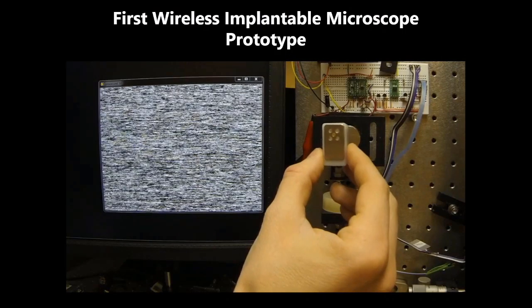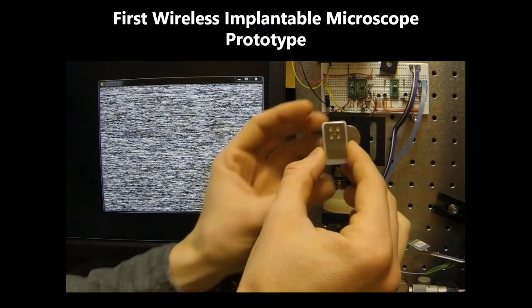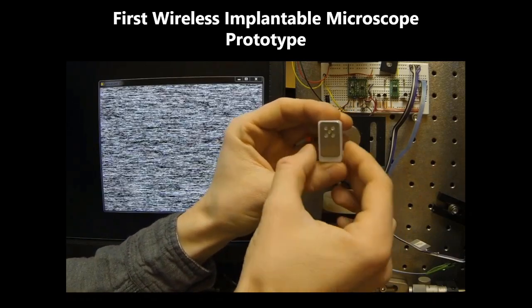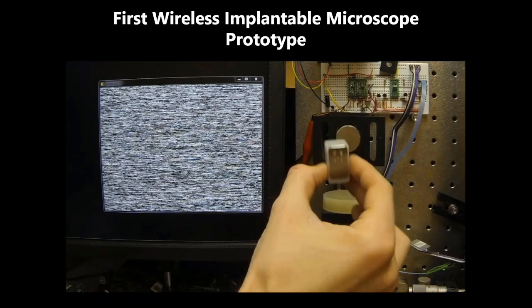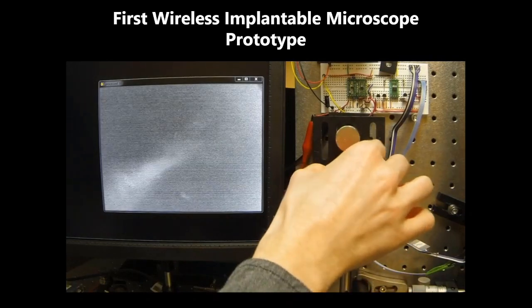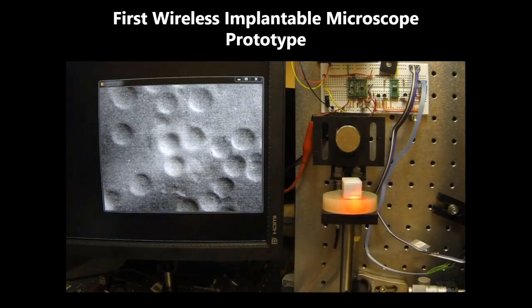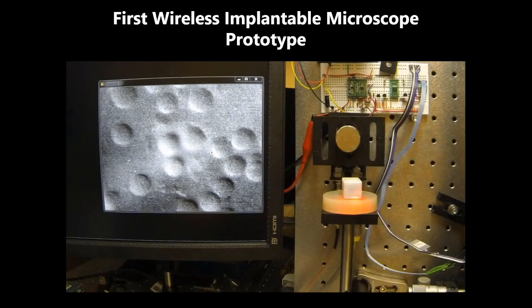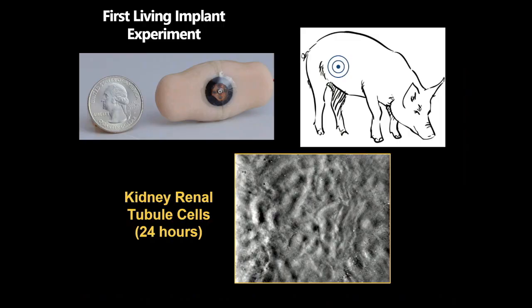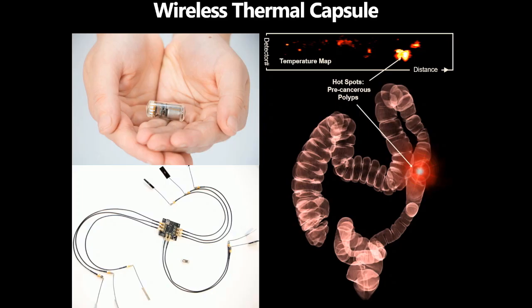So this is the first demonstration of a wireless implantable microscope. It's the postdoc showing that there's no wires. That metal disc in the back is a magnet that turns it on when it comes close to the device, and then it's on a phantom that has 10 micron beads, and now it's wirelessly transmitting images of the 10 micron beads up to the computer screen. And we've done this in pigs and have shown that we can get images of renal tubule cells for up to 24 hours.